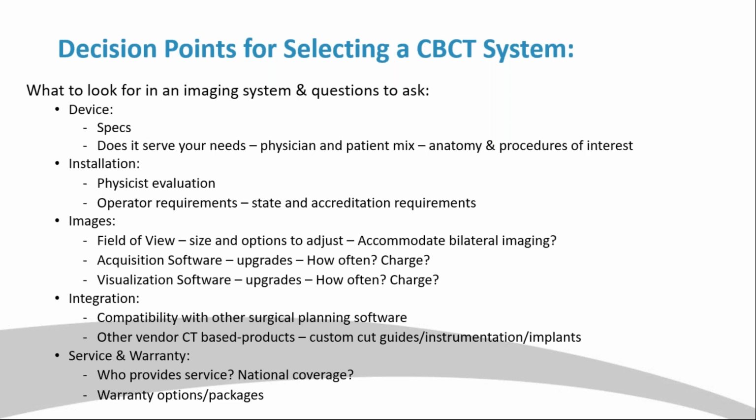Make sure you do your homework on all the different people in your office that are going to utilize this technology. And then finally, I would take a look at service and warranty. These are the little details that you just want to make sure you've addressed and asked those questions. So look at who provides service, national coverage, and then look into the different warranty options and packages for the different options that you have in front of you.